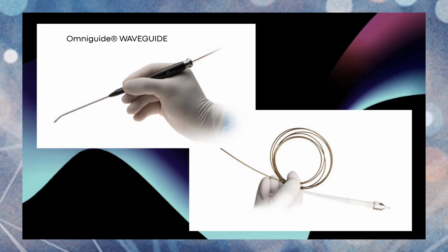Now, when you're using these CO2 systems, because the fiber can easily burn from clogging, they blow air through it. So a small amount of nitrogen is actually being blown through. But this is very important to know, because when you make a stapedotomy, you have to turn off this air, because then you will blow a jet of air into the vestibule, and this will do physical damage. So you can do considerable damage by just bubbling air into the vestibule.